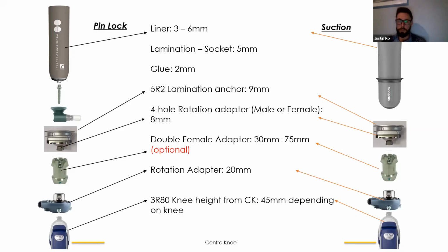Again, a lot of this boils down to funding as to what type of knee you're going to use, what type of liner you're going to use, and what components you're going to use in between.